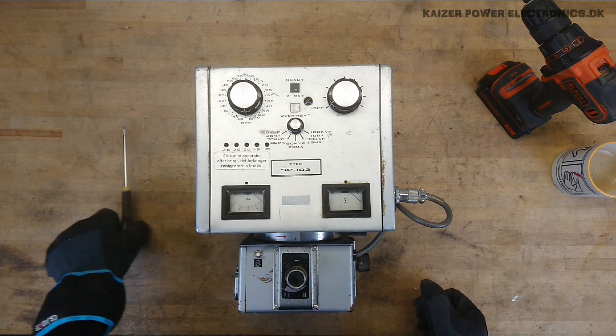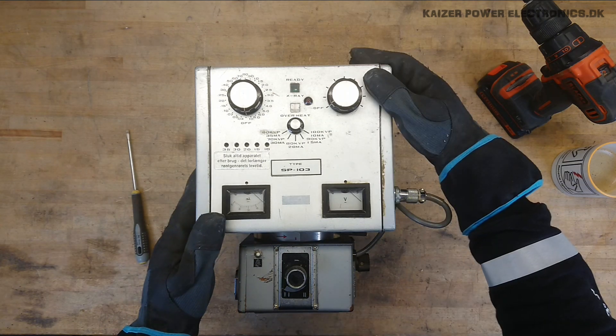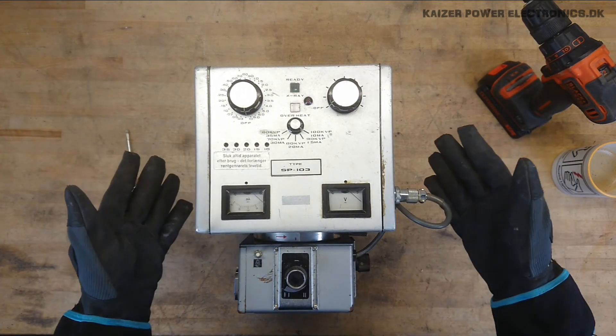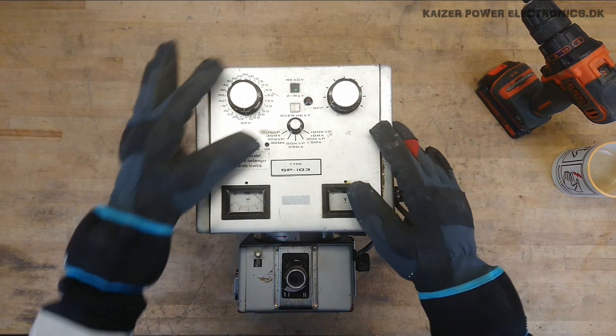Not quite sure of the manufacturing year — maybe we can see that on the inside. But it was last calibrated in 1999. Now, the controls for it are all here at the front. So it's a quite simple unit.